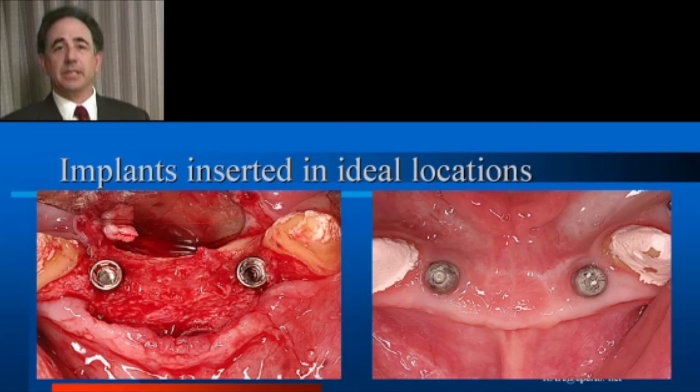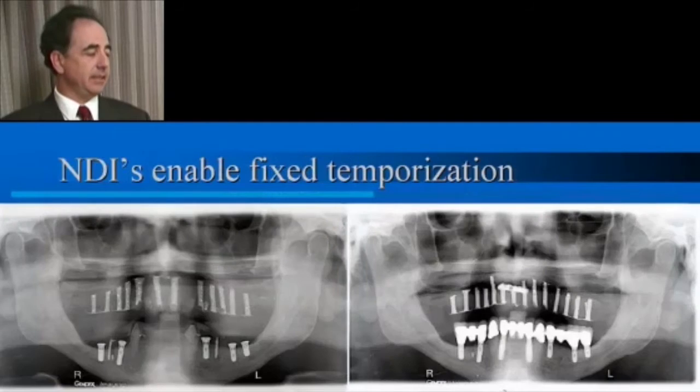What this enables is placement of dental implants to be restored in an aesthetic manner rather than what we used to do, and that was remove the coronal 1 millimeter width of alveolar bone, which in this patient would have placed the implants 3 to 4 millimeters apically, condemning the patients to long and unaesthetic teeth.